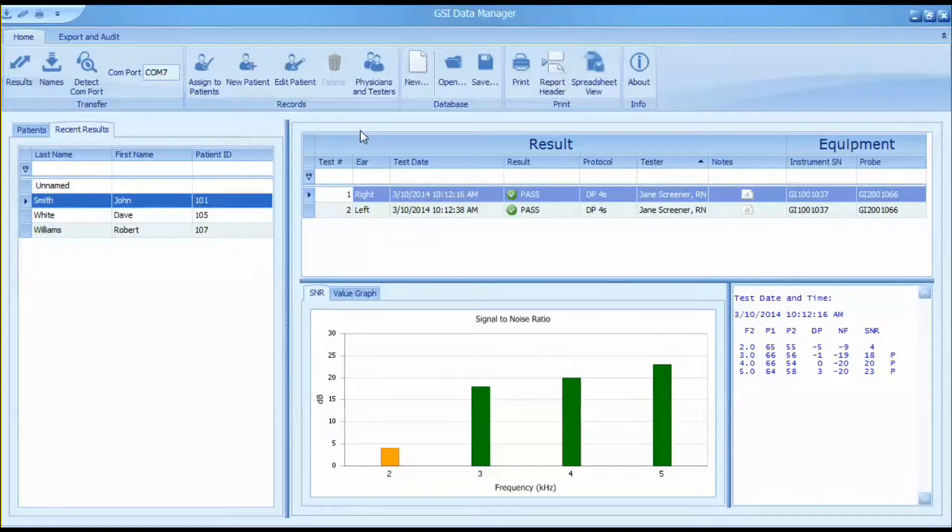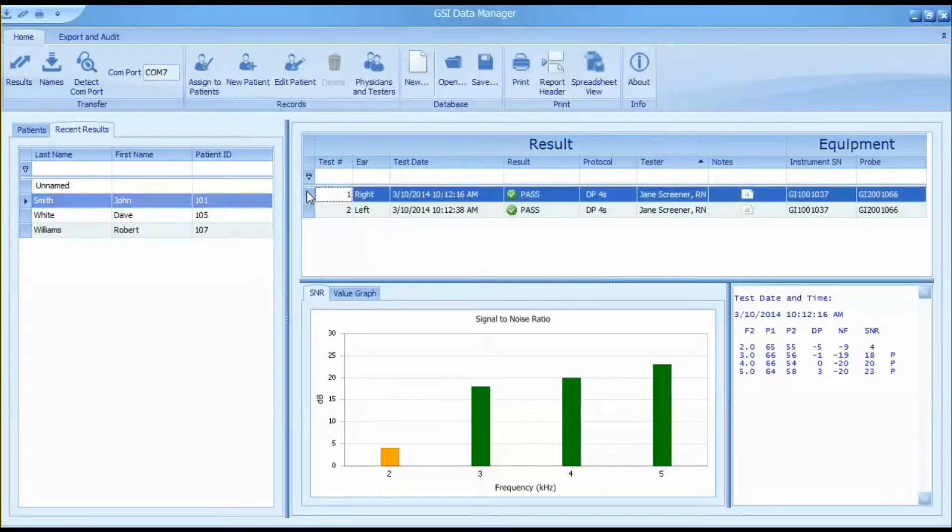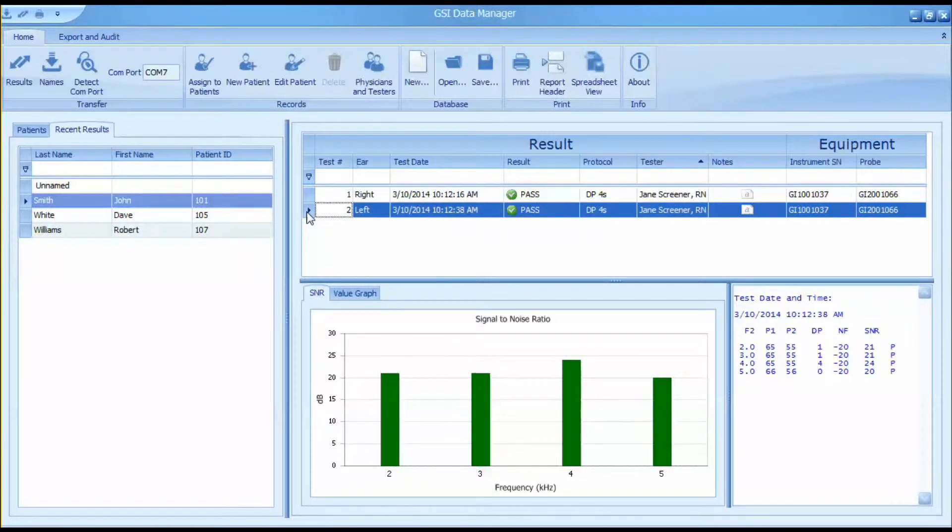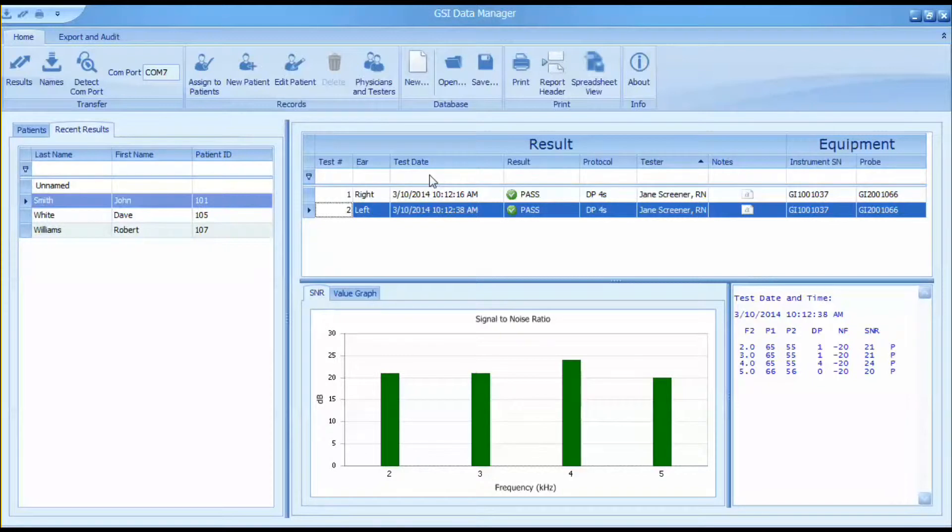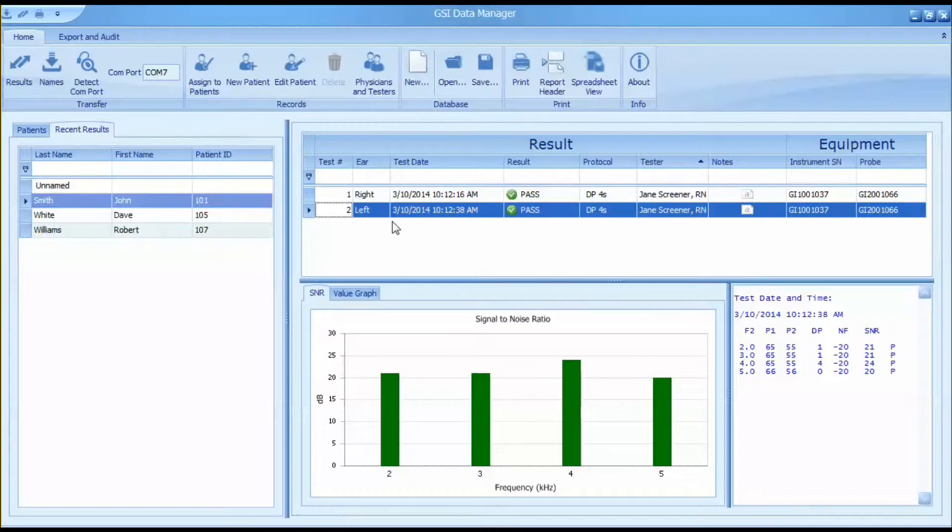In this example, two tests were completed on patient John Smith. The specific details of each test are stored including test year, test number, date of test, pass or refer, protocol used, as well as instrument and probe serial number.